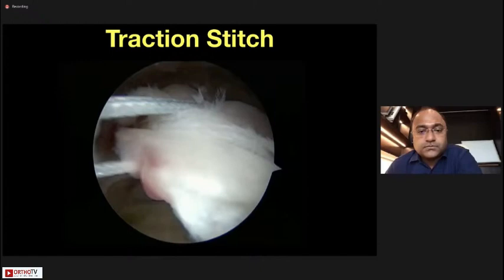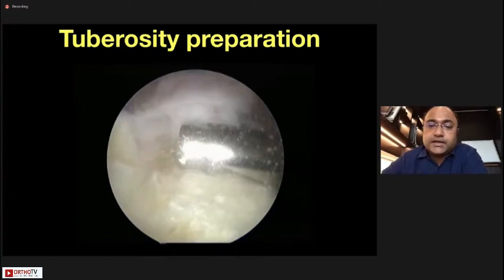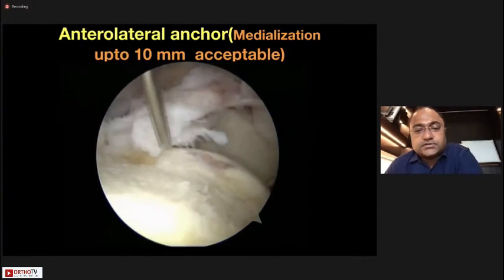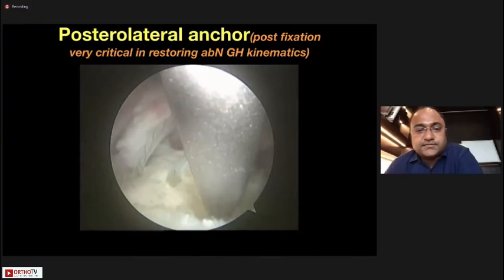Take traction stitches in different directions as needed, then prepare the tuberosity with very gentle decortication. Rotator cuff repair is like an unhappy marriage — poor-quality bone healing to poor-quality tissue. Get your spinal needle at a dead-man angle of near 90 degrees for perpendicular access to the subchondral bone right at the edge of the cartilage, then place your anchors. In this case I placed three triple-loaded anchors because of the massiveness of the tear.